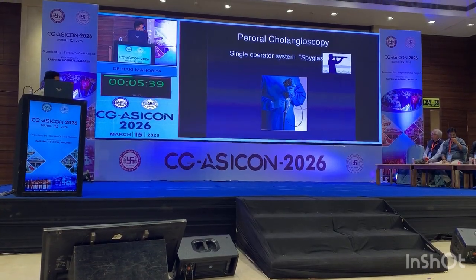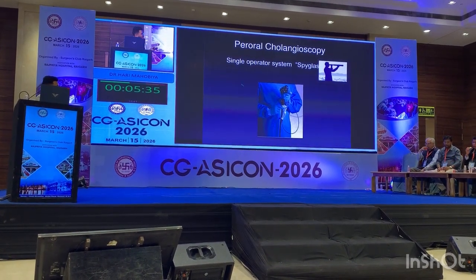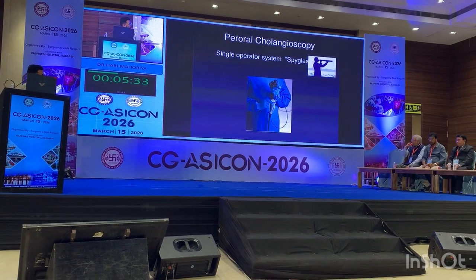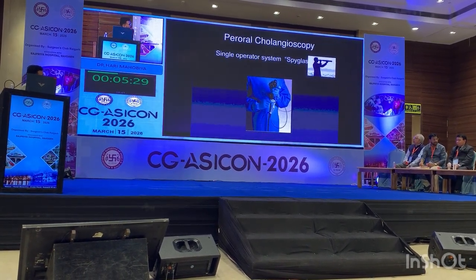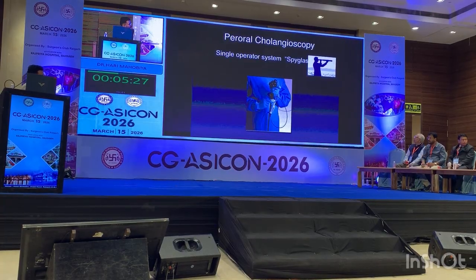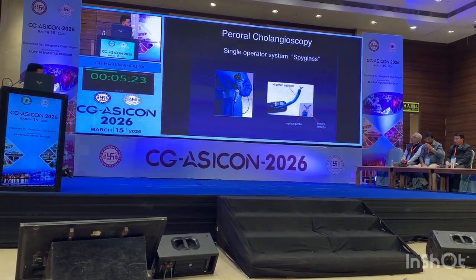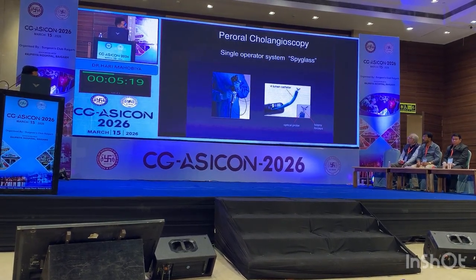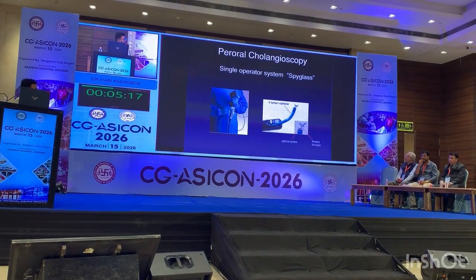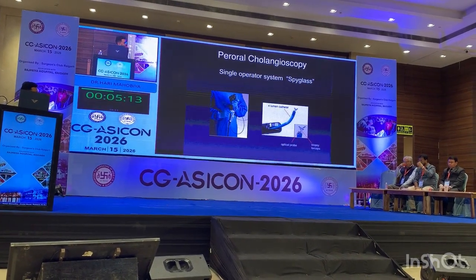And the next system is SpyGlass. This is single operator, and we are using it in our setup. This requires only one surgeon. This is an ERCP side-view scope, and this is a cholangioscope which goes inside through the biopsy channel. So this comes out from the side-view endoscope. It has a camera and light source, and it also has a small channel which we can use for biopsy forceps. The basket also can be used.